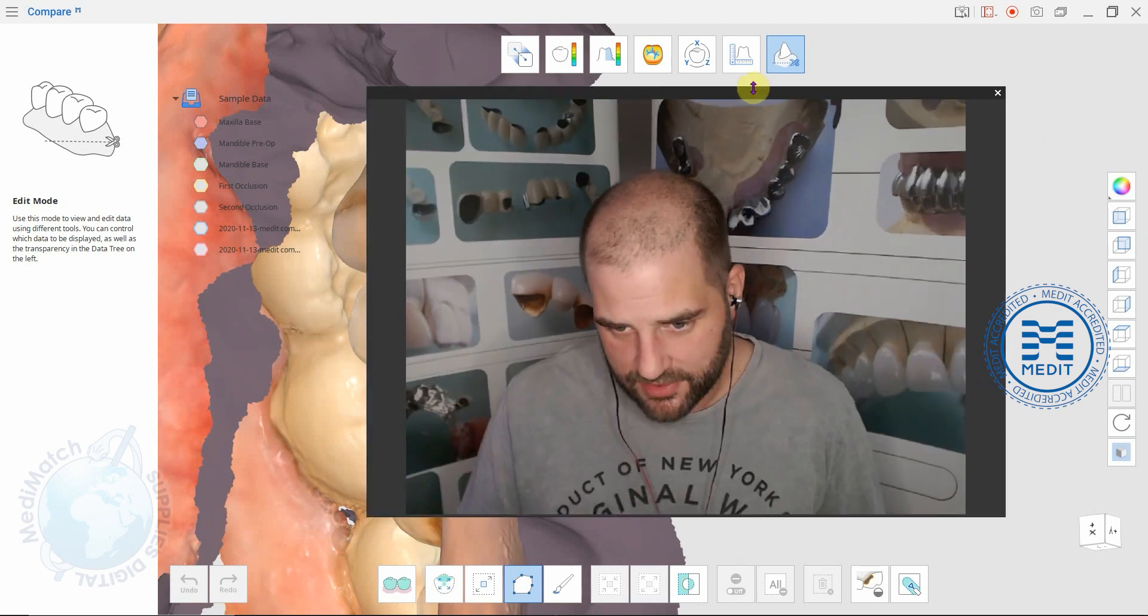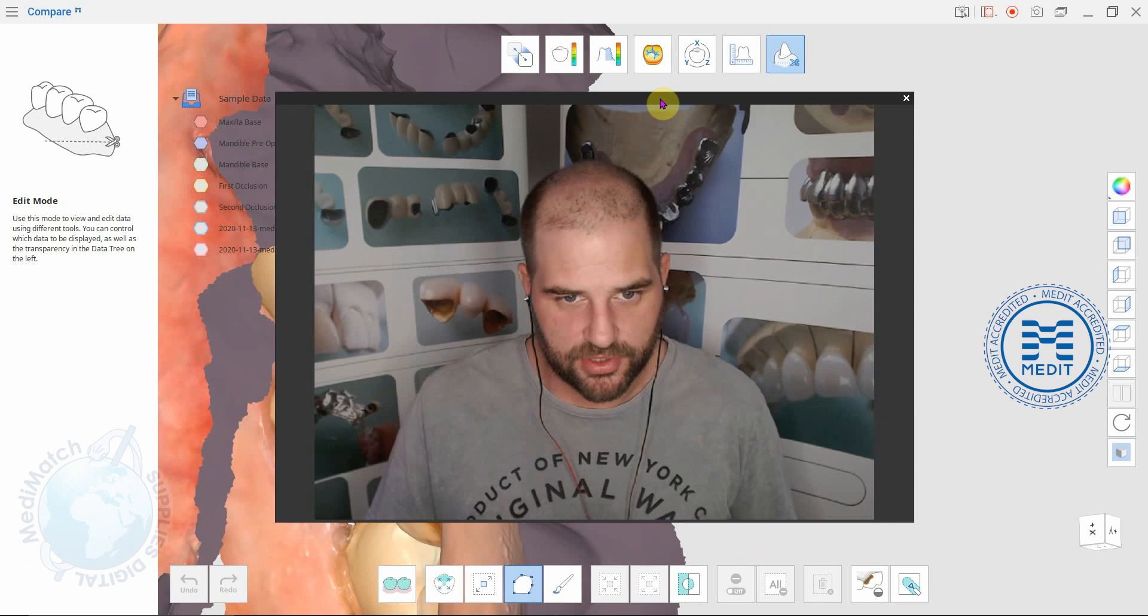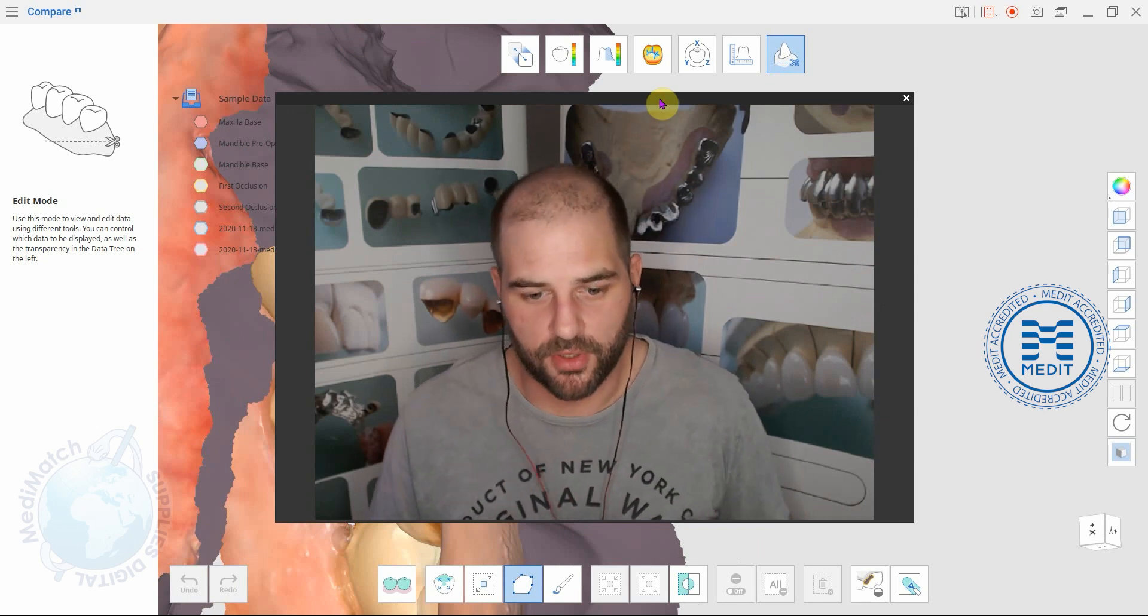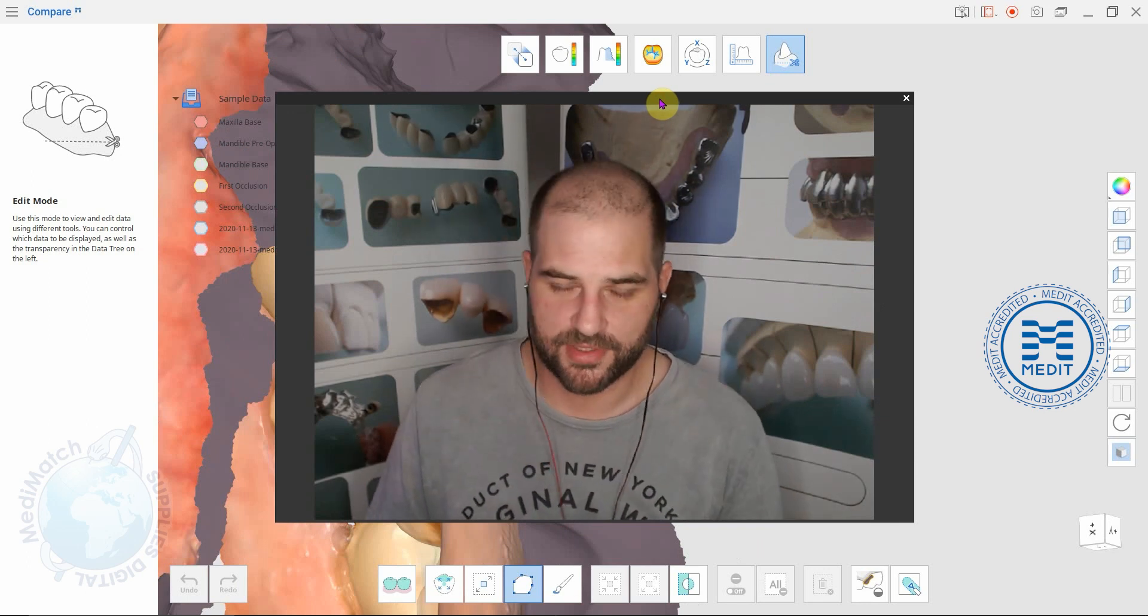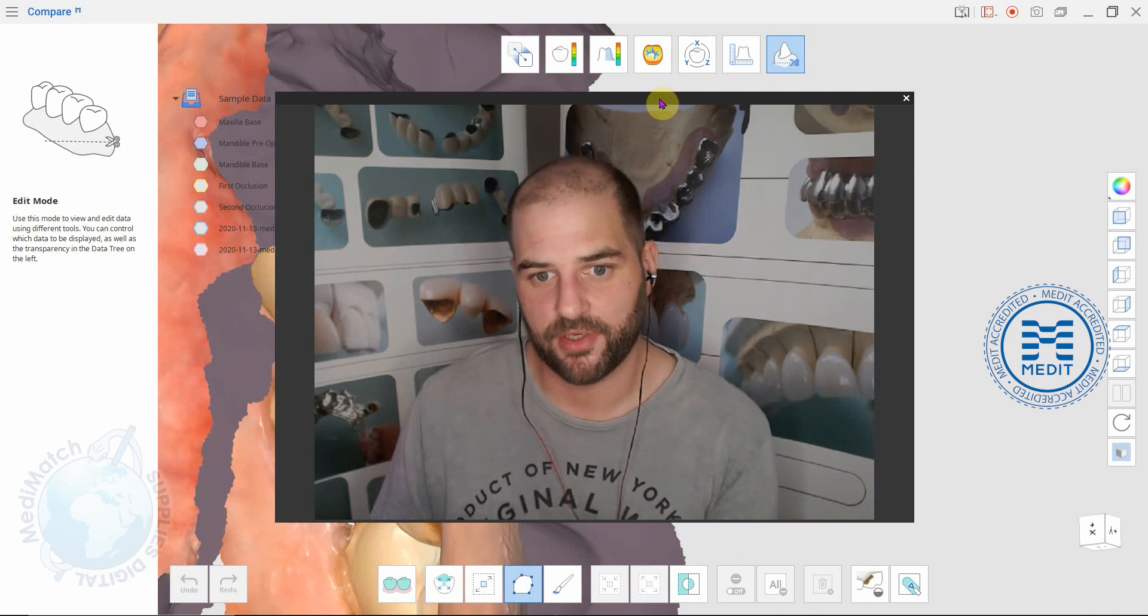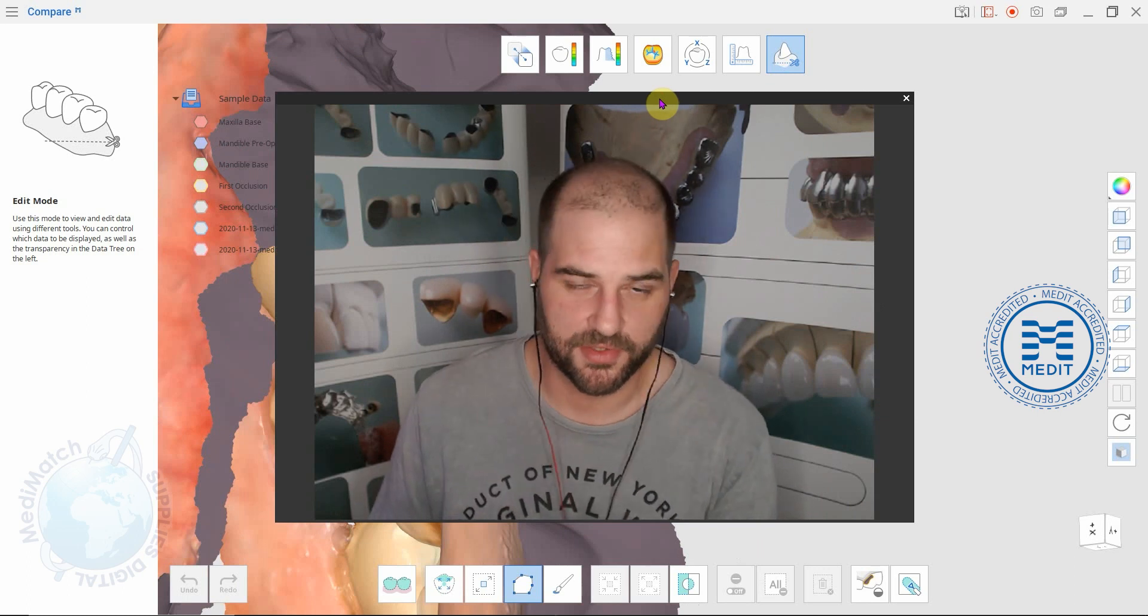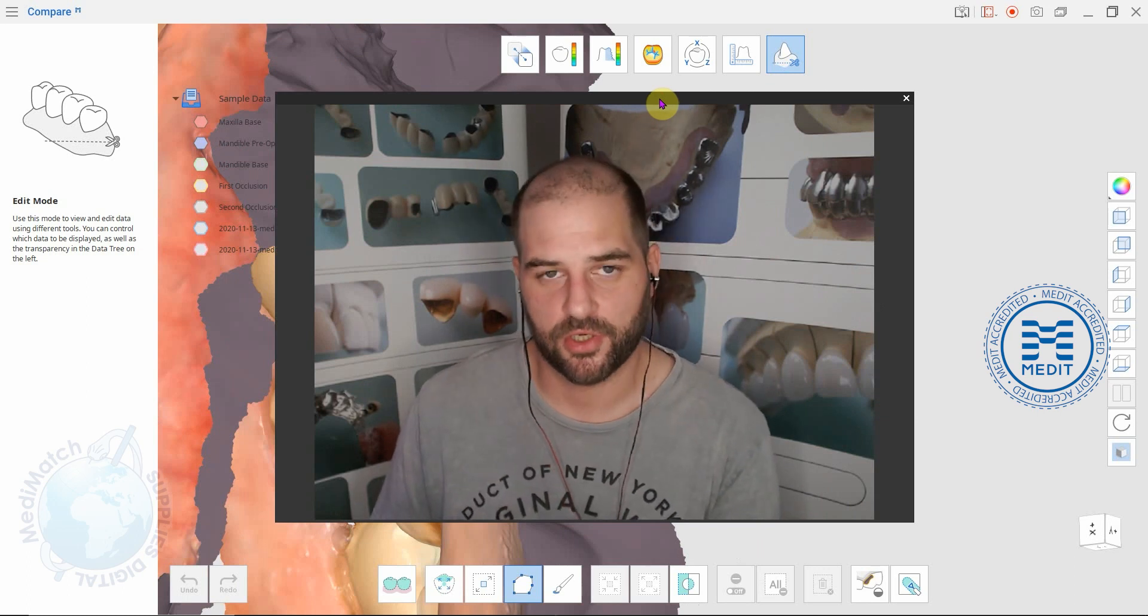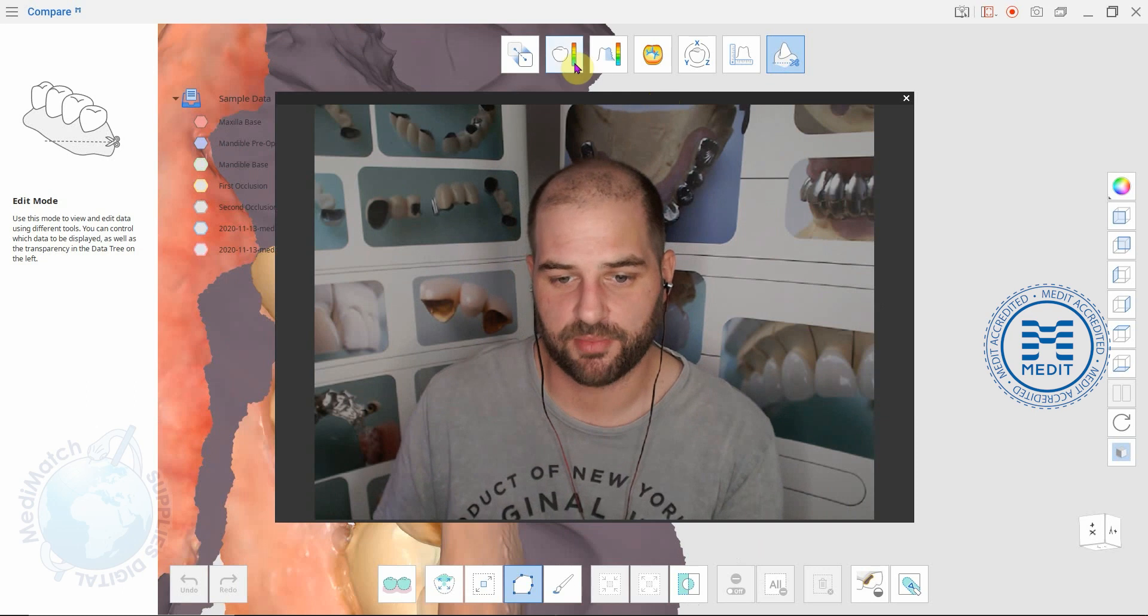This compare app is really good if you've got a patient who's grinding their teeth and you want to show tooth loss over time. You can load in data from today's scan and you can load in data from a scan six months ago or a year ago and show the difference on the deviation display mode.